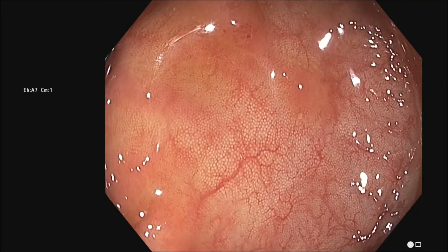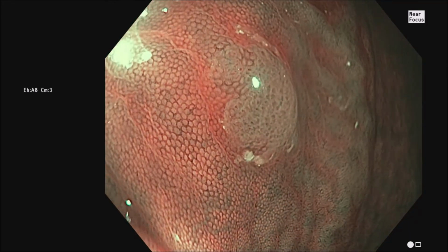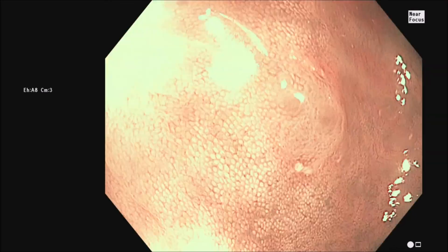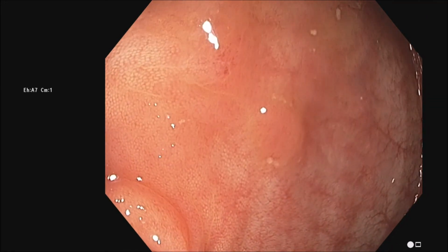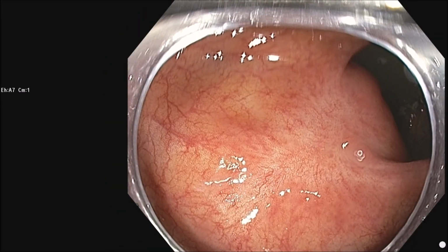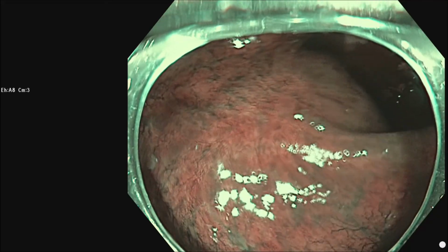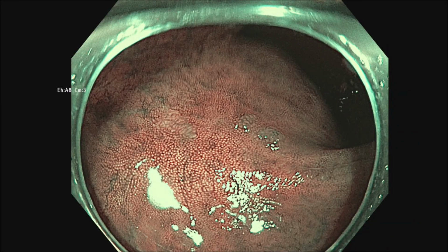Following up SSLs, first we're looking for a different type of pit, and now in close focus and MBI you can see a 3mm recurrence with the nice type 1 pattern, no blood vessels, uniform shaped dark pits. So in a second we'll see the larger scar again, SSL recurrence. Here's another SSL recurrence, large flat scar, no clip artifact because no clips were used to close the cold EMR. At the upper edge, 2 tiny little spots of residual SSL.